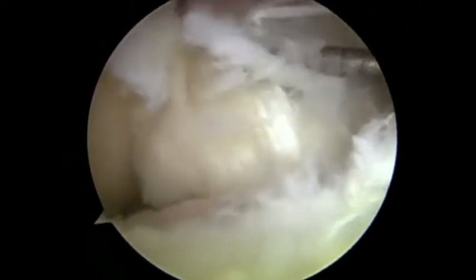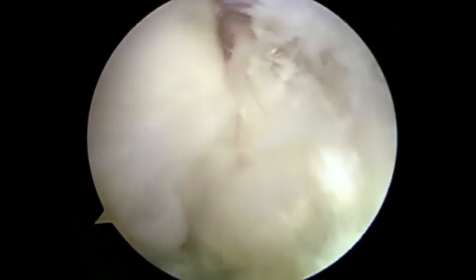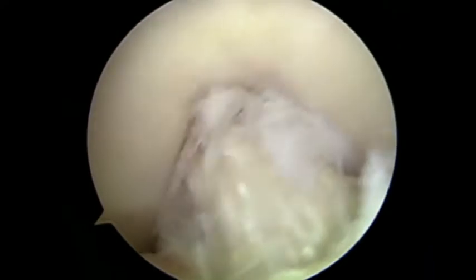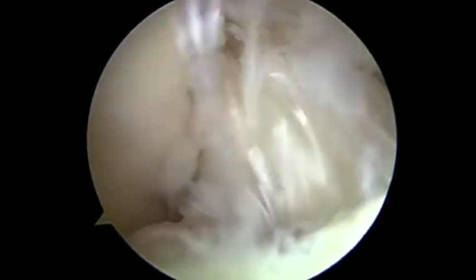Probing the integrity of the ACL confirms that the ligament is intact, but as the leg comes into extension at approximately 20 to 30 degrees, the engorged mucoid degenerate ACL can be seen to impinge on the roof of the femoral notch.